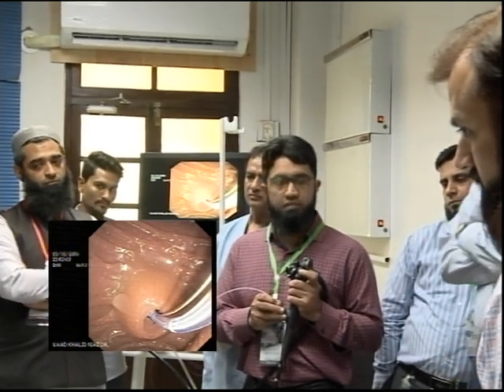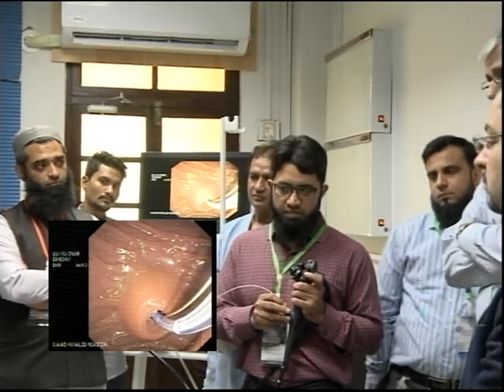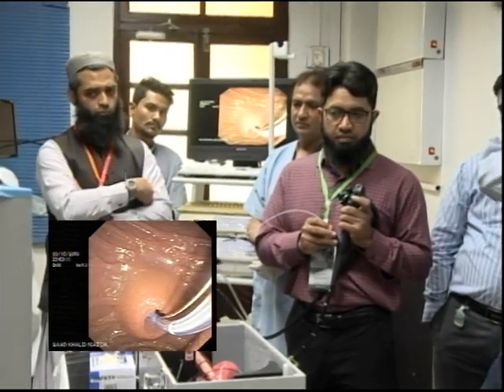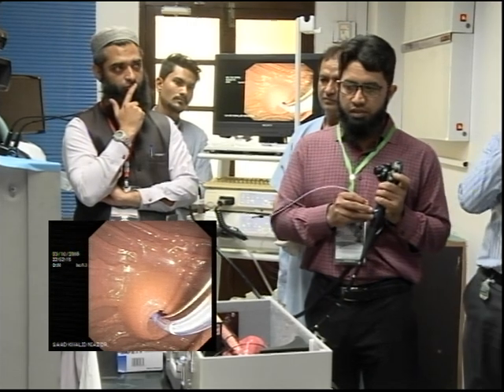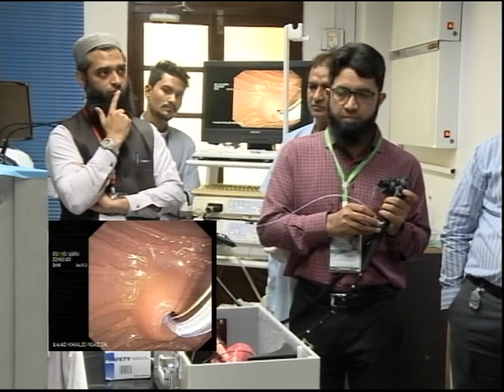Do you think you are in the pancreas or in the CBD? I think pancreas. If you want to go a little bit more towards 11 o'clock, what options do you have at the moment? Okay. What else?